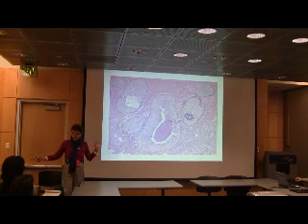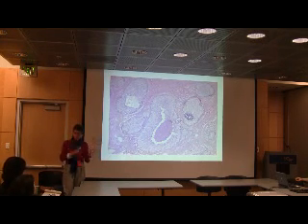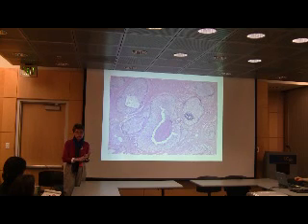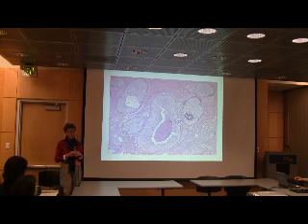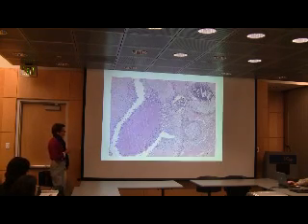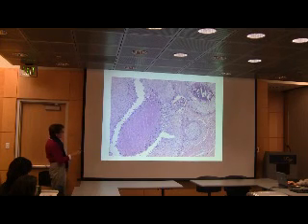So we've separated it out. So now we look at nuclear grade and pattern and the presence of necrosis, and we do them separately, so it's not just one package. Next. So this is just a little bit of higher magnification.